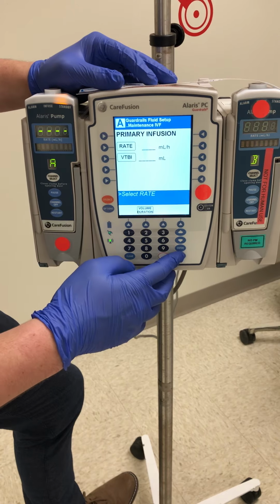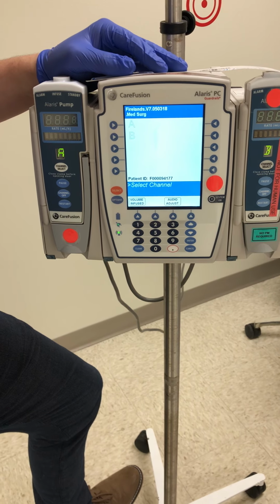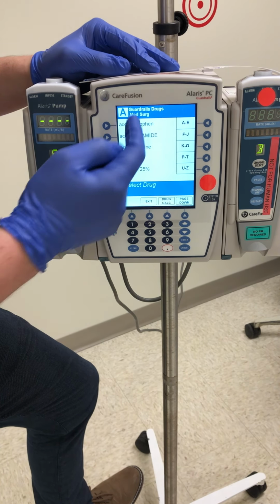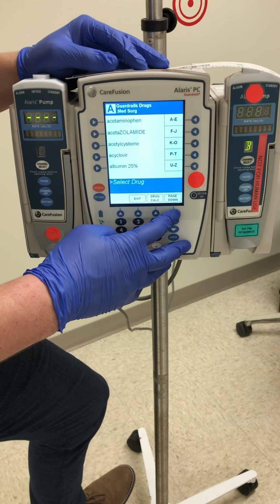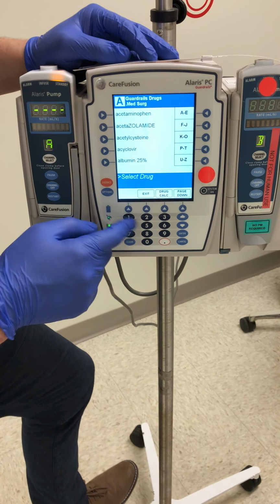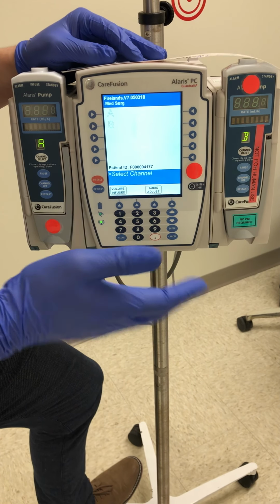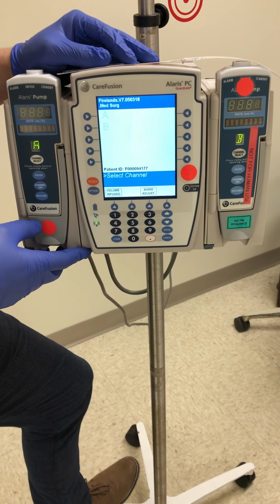I'm going to hit cancel and go back to the main screen and show you how we will do secondary IV medications. We'll once again select our proper channel, go to guardrail drugs. When I do that, you'll see all these different options of pre-programmed medications. Again, if you are unable to find the medication you're looking for, we'll contact pharmacy and we'll have them program that with the correct guardrail limits. You can hit exit and go back to the main screen. You'll notice the IV pump beeps periodically if you're waiting on a screen and not pressing any buttons. That's just to remind you that it's waiting for you to properly input the information.